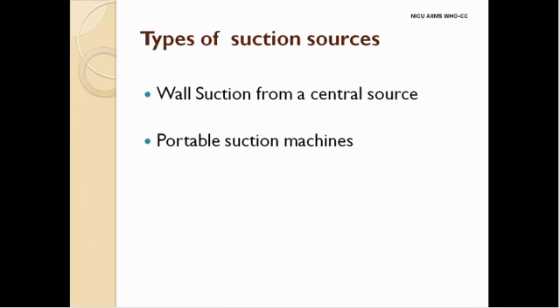We should also know about the different types of suction sources available to us. There are basically 2 types of suction sources. First is the wall suction and then is a portable suction machine. We shall discuss about them in detail in the subsequent slides.